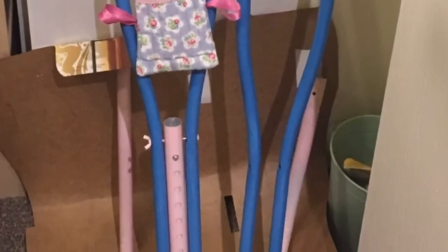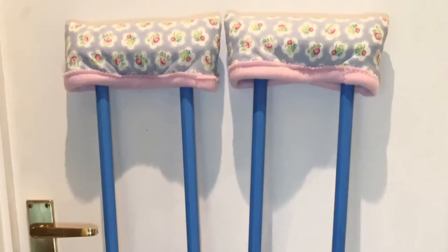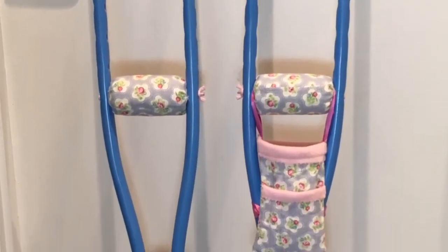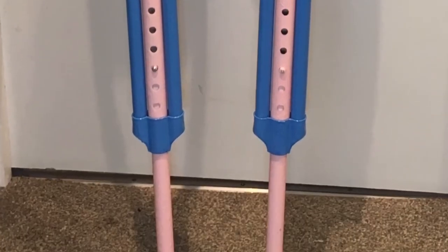Once you've added your clear protective coat and that has fully dried, it's time to start assembling your finished crutches. I also sewed a little quilted pouch with a pocket that was tied on by ribbons, that I could put my phone and keys in while using the crutches.